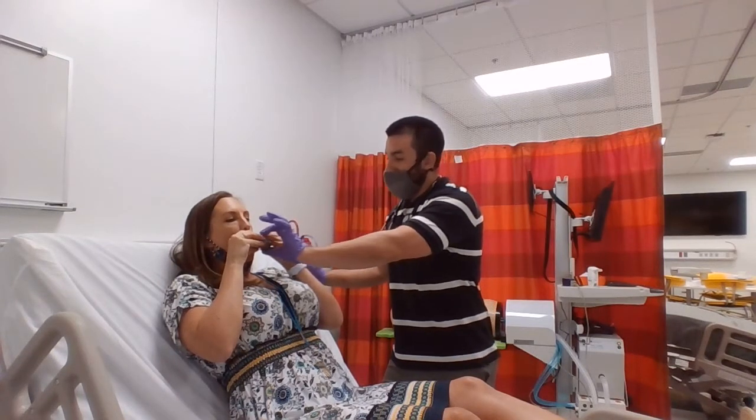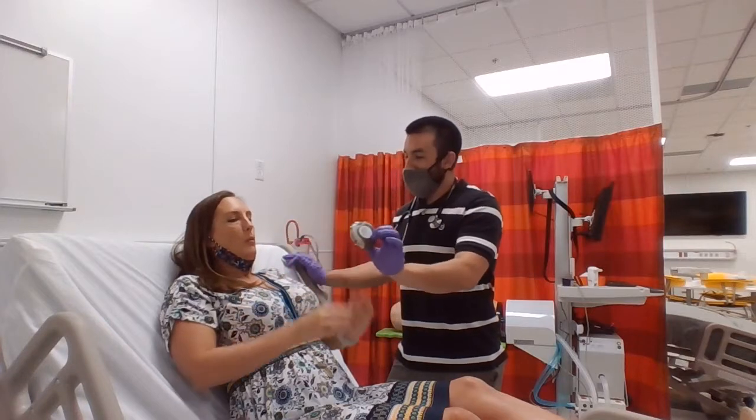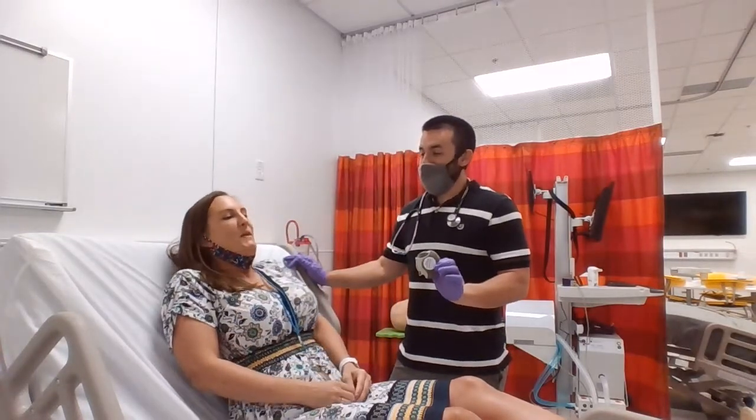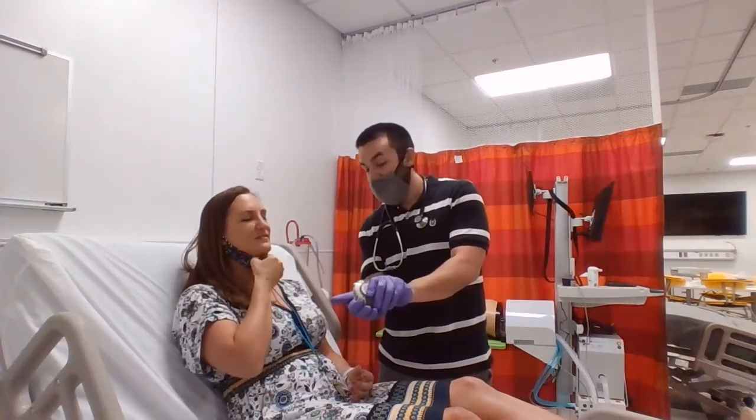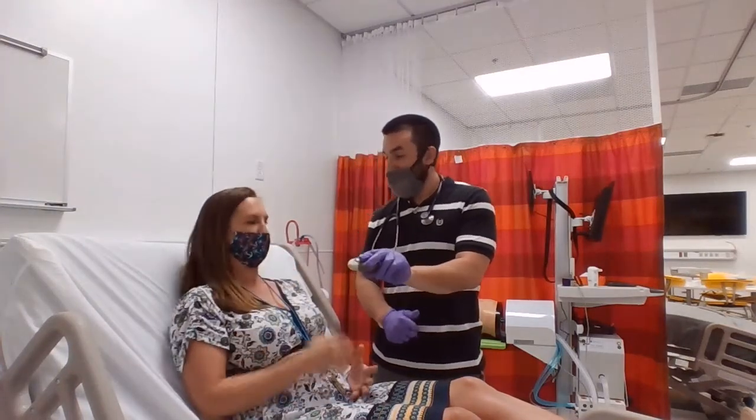You don't have to gum the inhaler or anything like that. You just got to hold it there. I'll take that from you. That was 10 seconds. Yeah, that was pretty good. So then all you're going to do is close that, and it's all ready to go.